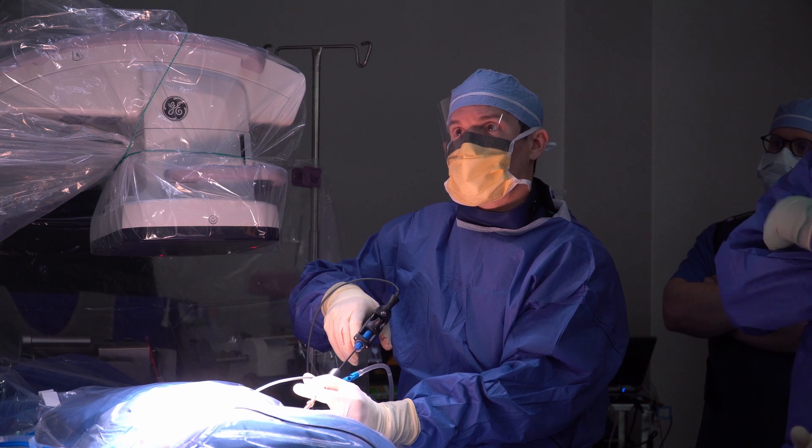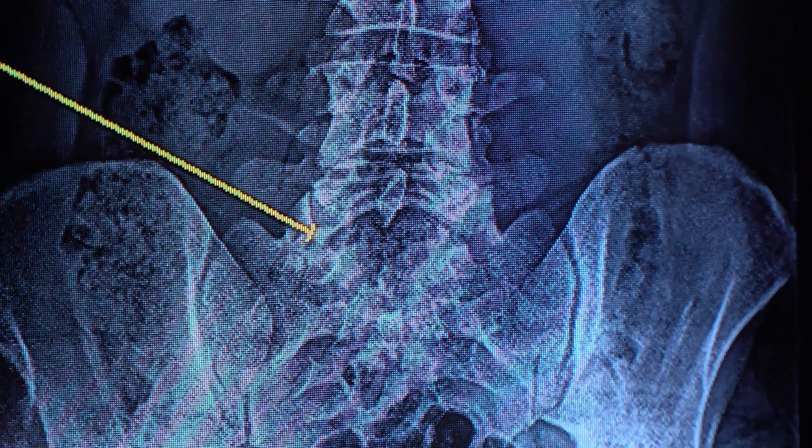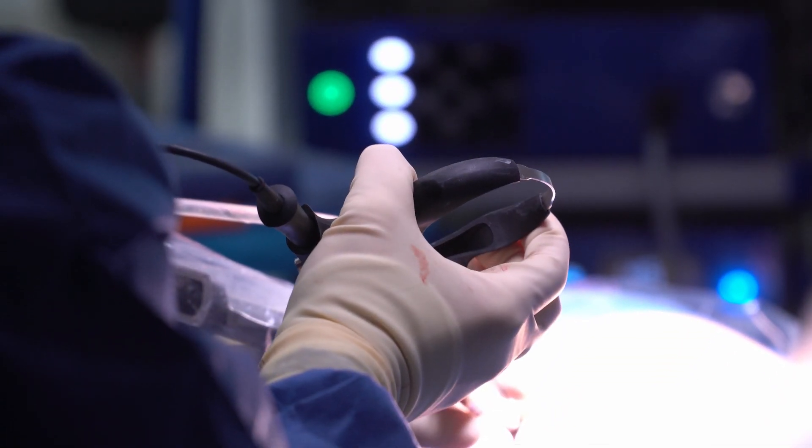You can directly visualize the problem and then access it through a series of micro instruments. After you remove the camera at the end of the procedure, the patients get one stitch under the skin and basically a glorified band-aid, and go home the same day.